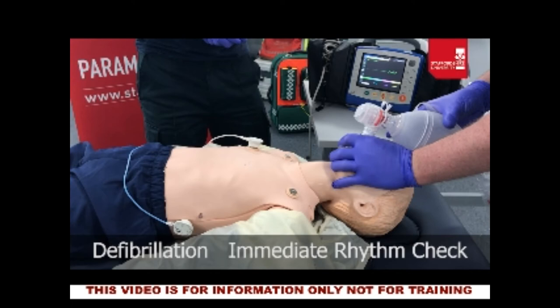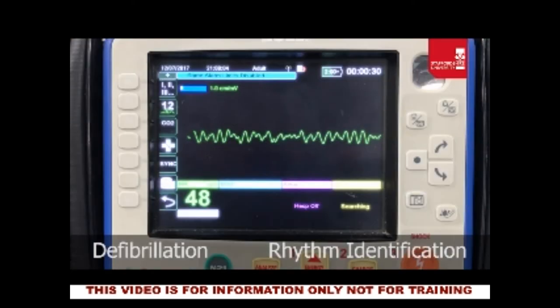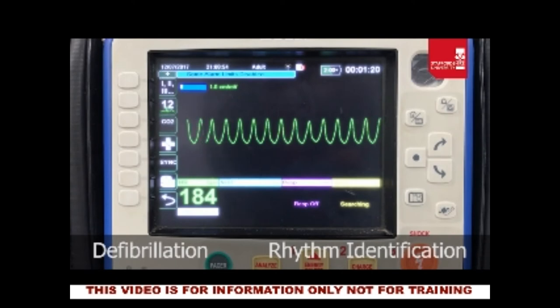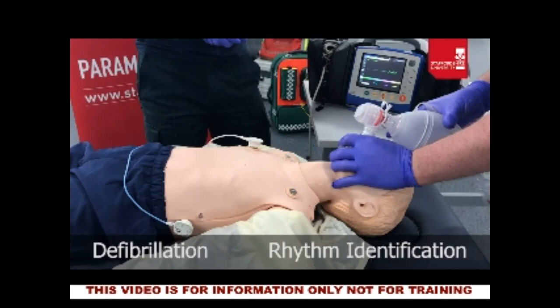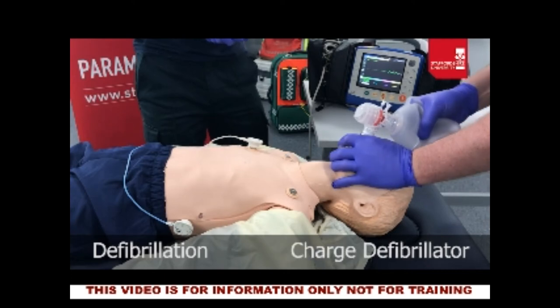How you proceed depends on whether you are in a shockable or non-shockable rhythm. Your shockable rhythms are VF and pulseless VT; your non-shockable rhythms are asystole and pulseless electrical activity or PEA. The first thing you need to do is correctly identify the rhythm. On this occasion we are in ventricular fibrillation — a shockable rhythm — so we are going to charge the monitor.